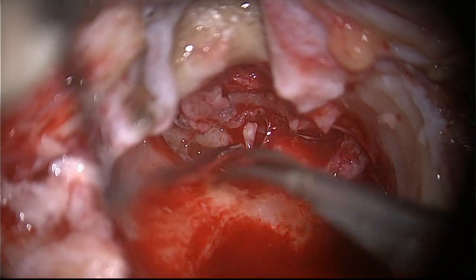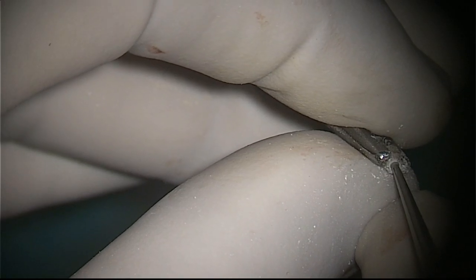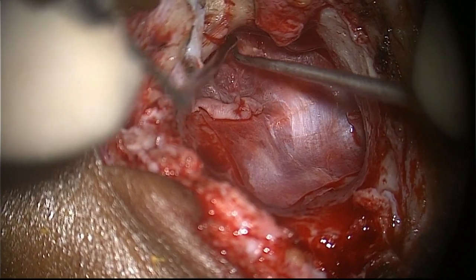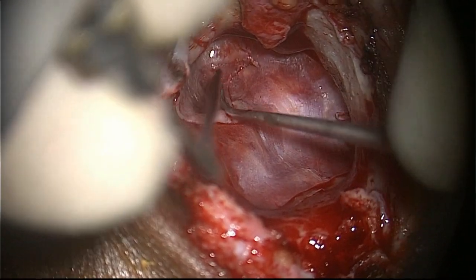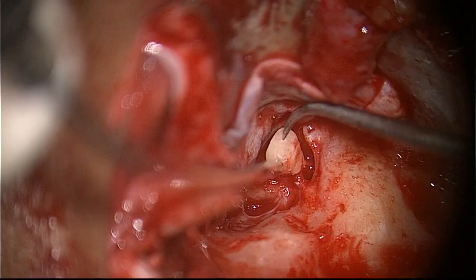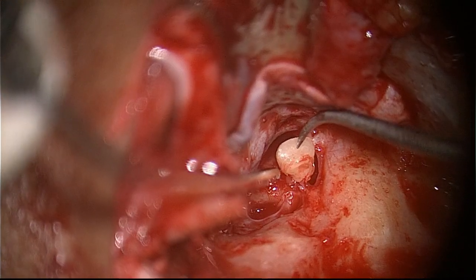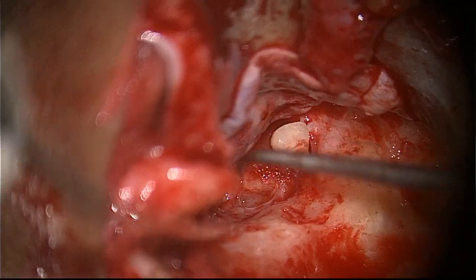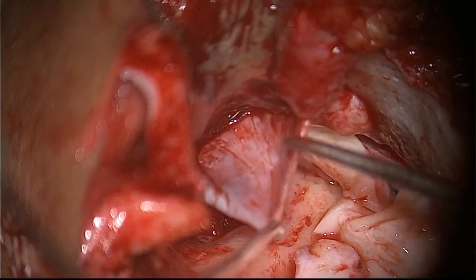So now you can see this is a canal wall down technique done for cholesteatoma where there is an intact and mobile stapes, wherein I am using the autologous bone which is sculptured and made exactly like the head of the malleus, where it is made to sit on the mobile stapes, you can see. This should not be too long so that it will not have a tenting effect like that. And you can see canal wall down technique.